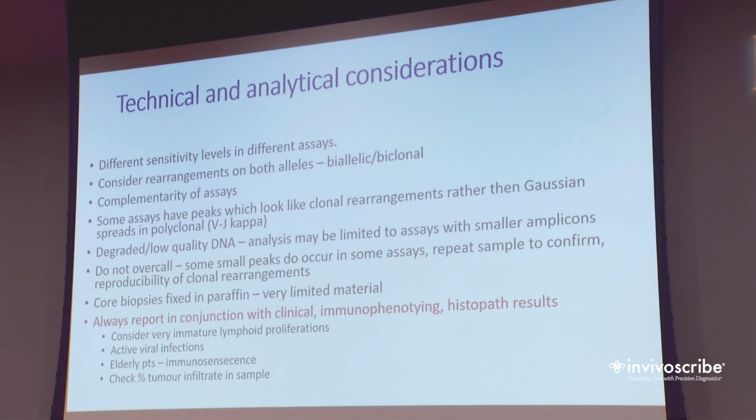Okay, and very important not to overcall. Okay, especially in some of the assays that will give you slight little peaks, but that's all to do with experience. Okay. Some of the things we're finding now more and more, when I first started, we used to get lovely excision biopsies. But of course, as the healthcare system goes on, less time in day wards, we seem to be getting a lot of core biopsies now sent to us. And by the time they finished immunohistochemistry, there's really very little left in these. So that's definitely very challenging.